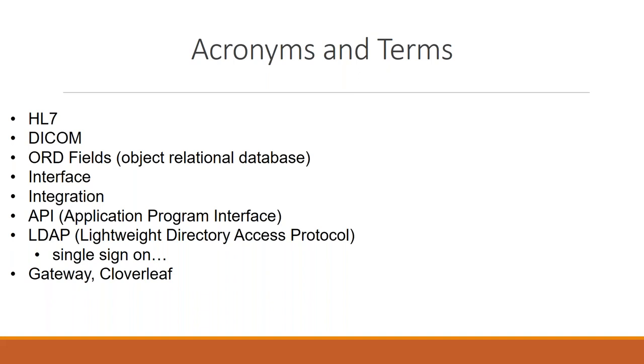And they also call it single sign-on. So if you ever hear LDAP or single sign-on, that's what it is. It's that interface or integration, depending on the products, that launches everything from that single sign-on.